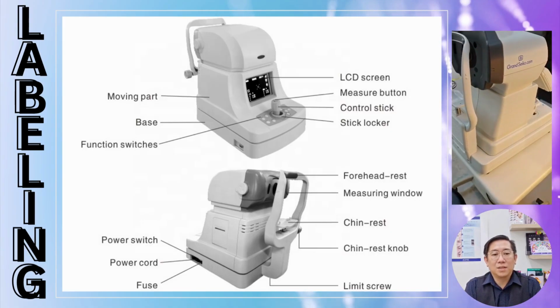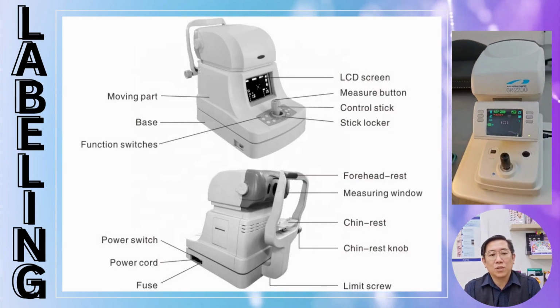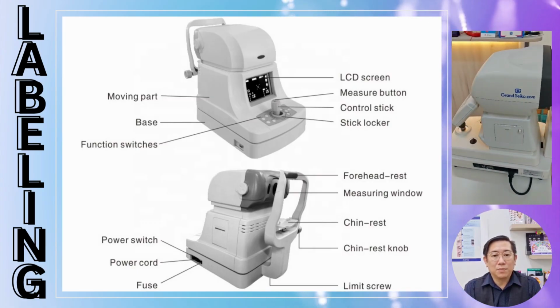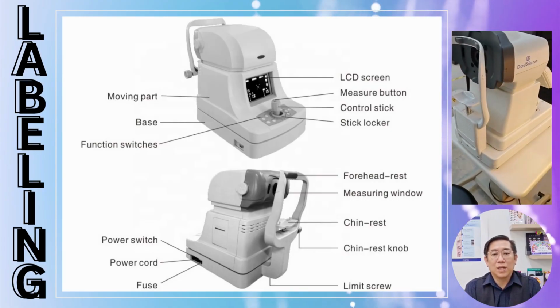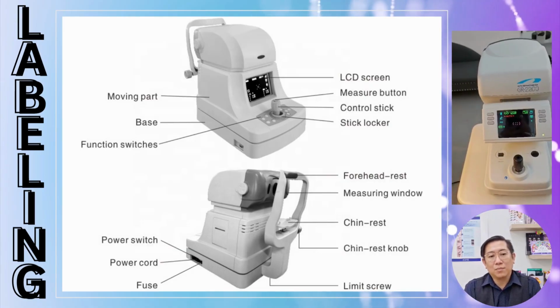Okay, these components may vary in different models of autorefractors, and the components work together to ensure accurate alignment, stable patient positioning, and efficient measurements. The design focuses on operator control and patient comfort, making the autorefractor a practical and reliable tool in modern optometry.